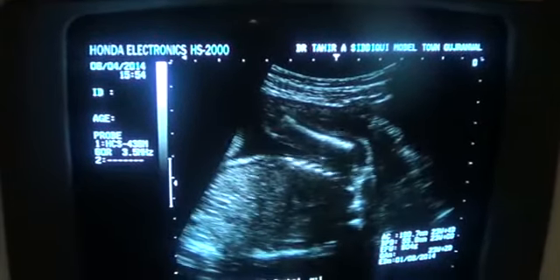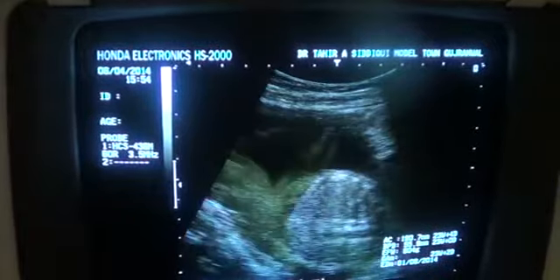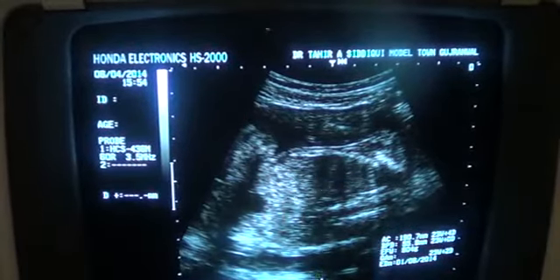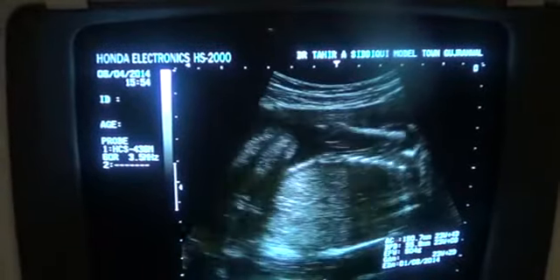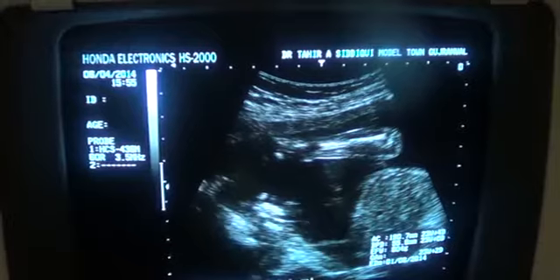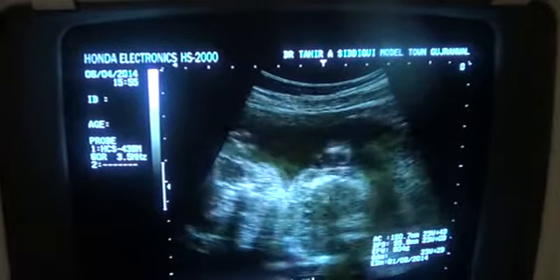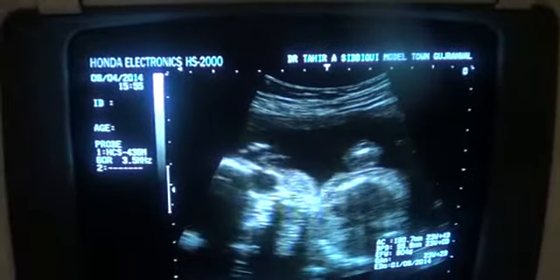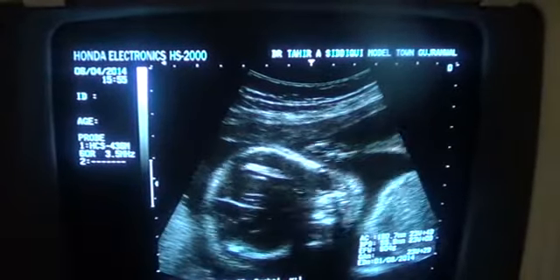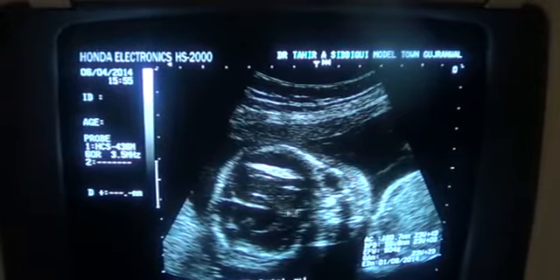This is the femur, and in longitudinal view for this fetus, see the urinary bladder. This is the urinary bladder, and this is the hand of the fetus. These are the eyes. This is one eye, and now the second one. These are the two eyes with dilated ventricles and falx cerebri.